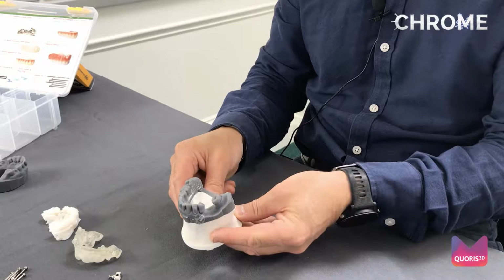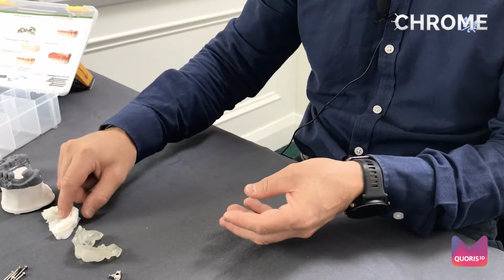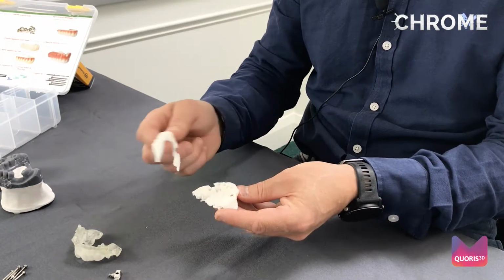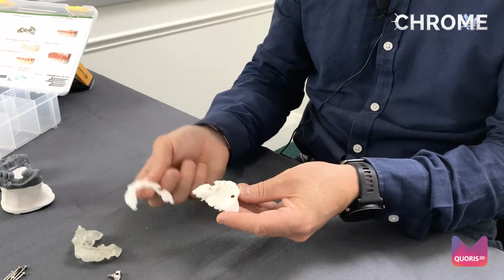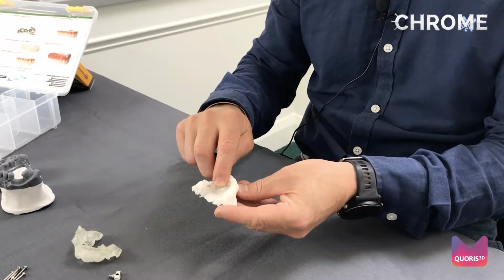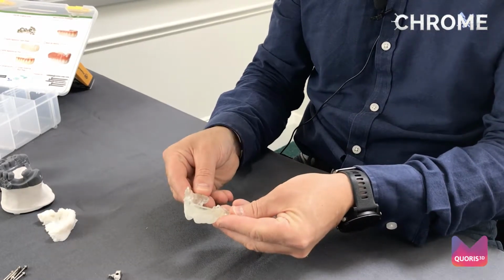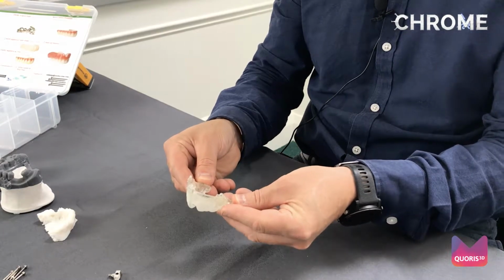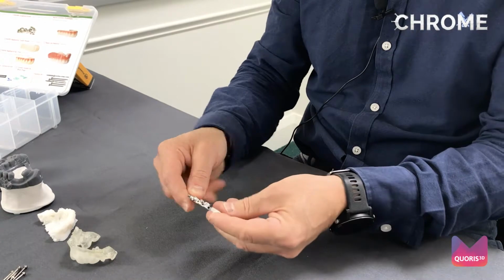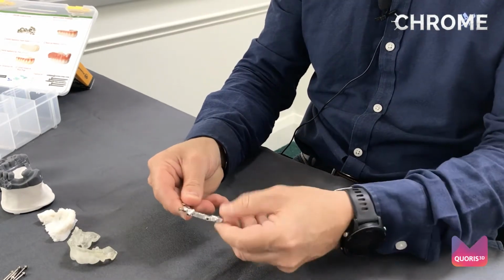We've also got our lower printed model of the opposing dentition. We've got our bone reduction guide, our model that has been agreed at the time of planning, and you can see how much bone is going to be removed. You've got your pin guide, which helps position your fixation base. You've got your fixation base with the Swiss locks, in this case 3 in place.